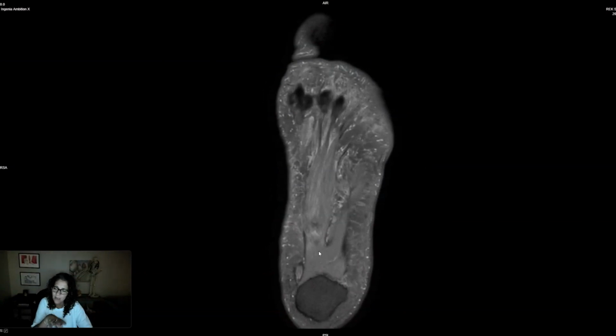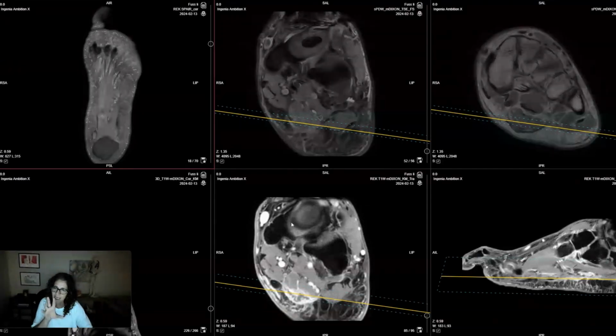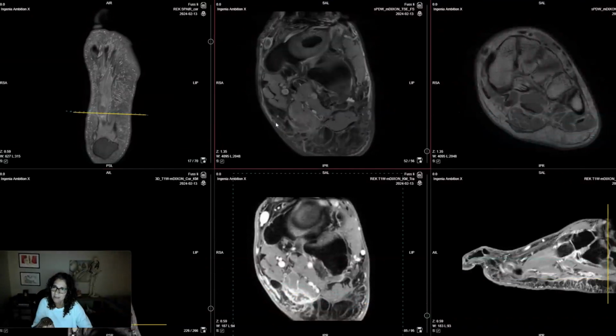imaging. So if I'm doing imaging of the forefoot and I had metal in the hindfoot, I wouldn't want to do all of these proton densities because it's just escalating the issue and making more artifact. But I would definitely want to get a sagittal STIR, a short axis T2 fat sat. Or an axial PD fat sat. I could try that in the forefoot using a field of view.